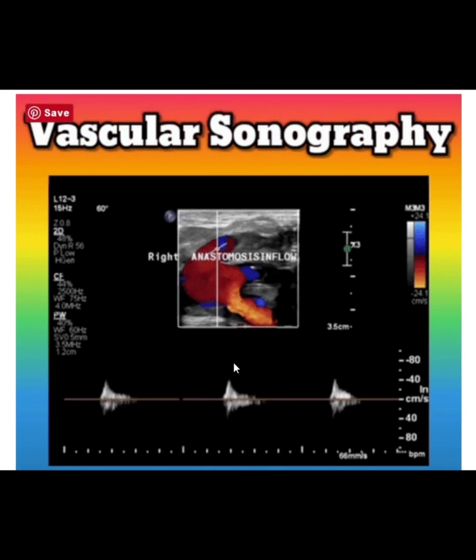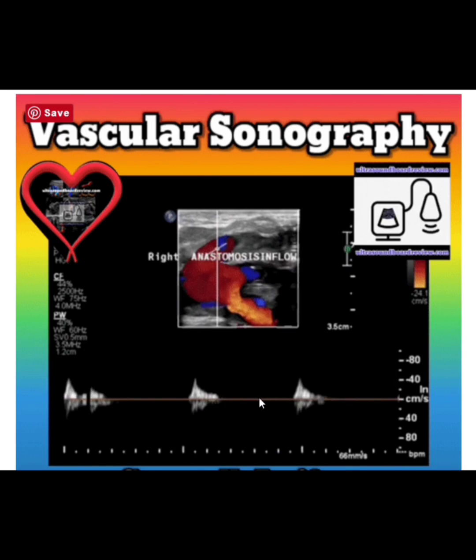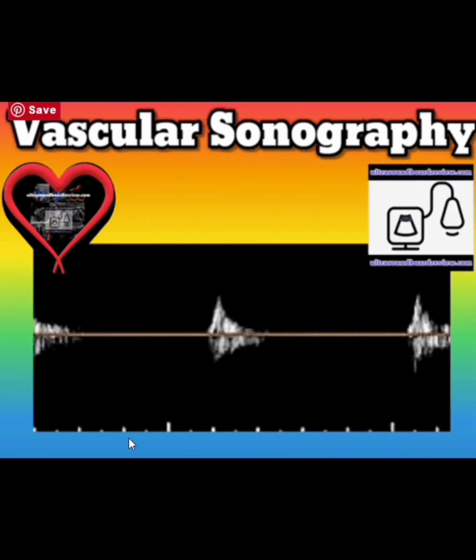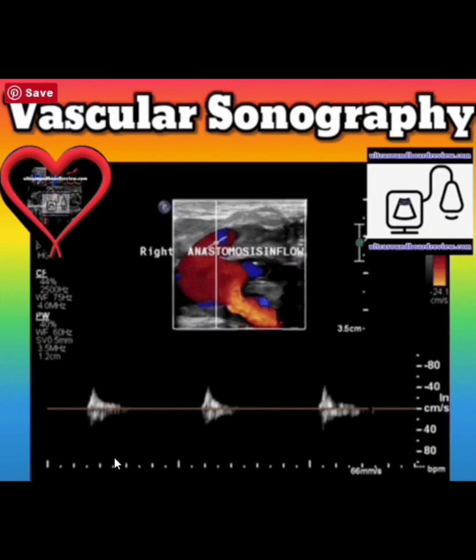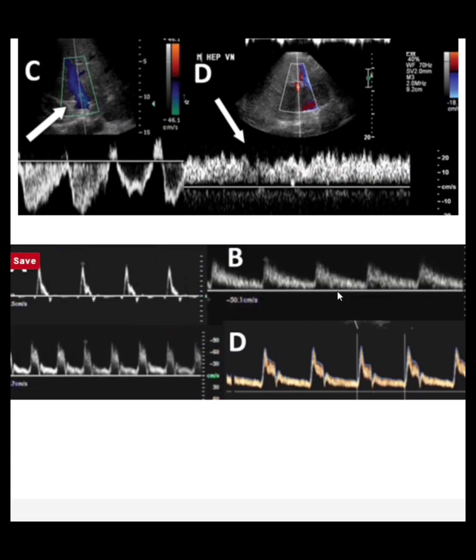This is another example of low velocity, high resistance flow with no flow in diastole. That means you're evaluating upstream or proximal to the disease, and the disease is downstream or distal. Keep in mind that any normal artery feeding an organ will have somewhat lower resistance flow throughout diastole, while still maintaining that echo-free spectral window space.